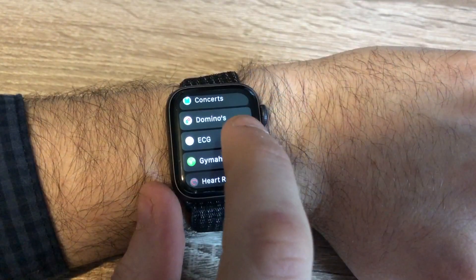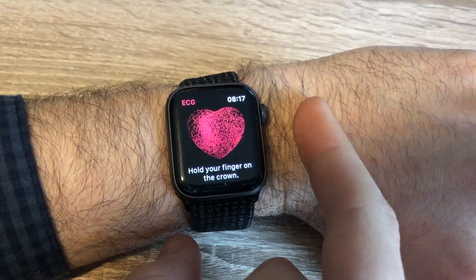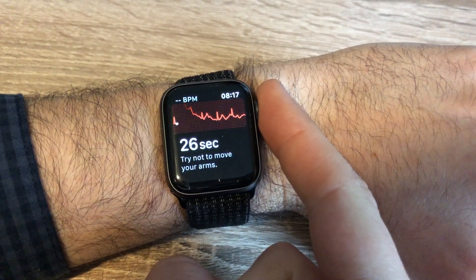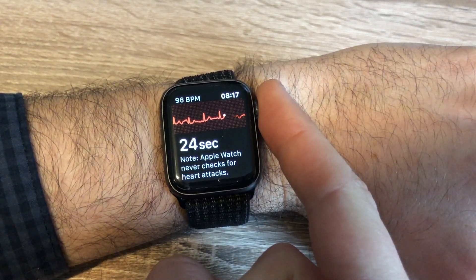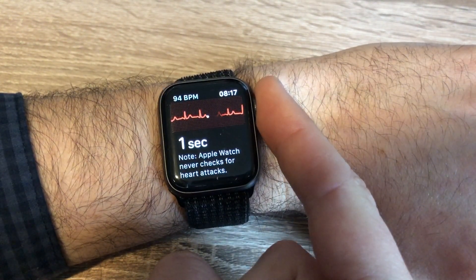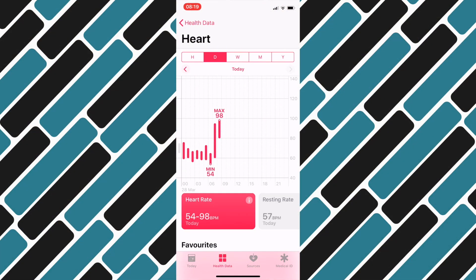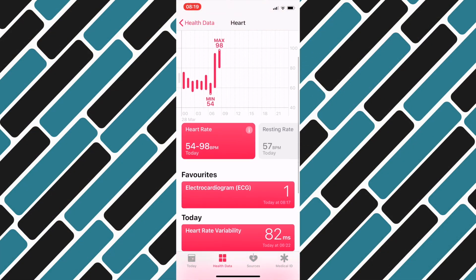Next, go back to the ECG app on your watch and it will talk you through the process of taking an ECG. This basically involves keeping your finger on the crown and making sure the watch strap is nice and tight for about 30 seconds. You'll then be able to see the results on your watch, or dive into your phone to view previous results, export them, and find out more about what some of the stats mean.